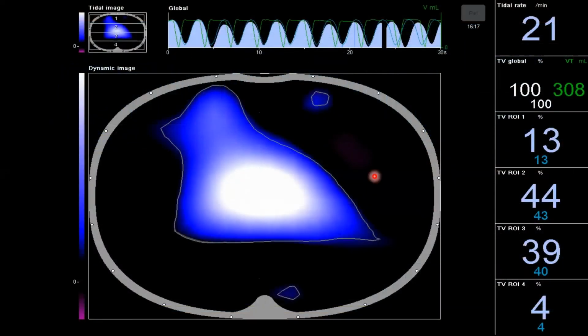Here's another case that we had where we had severe abdominal distension. It was a post-op patient. CT scans showed a very dilated colon.